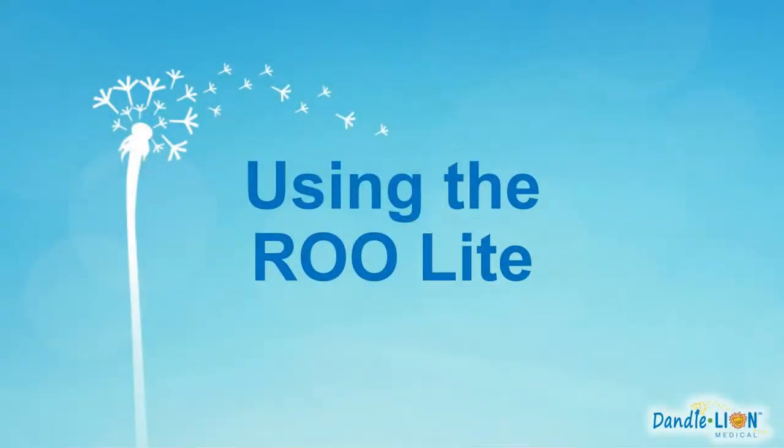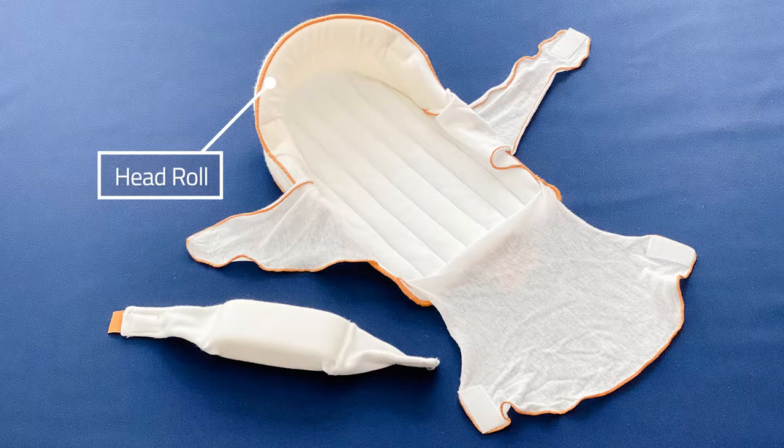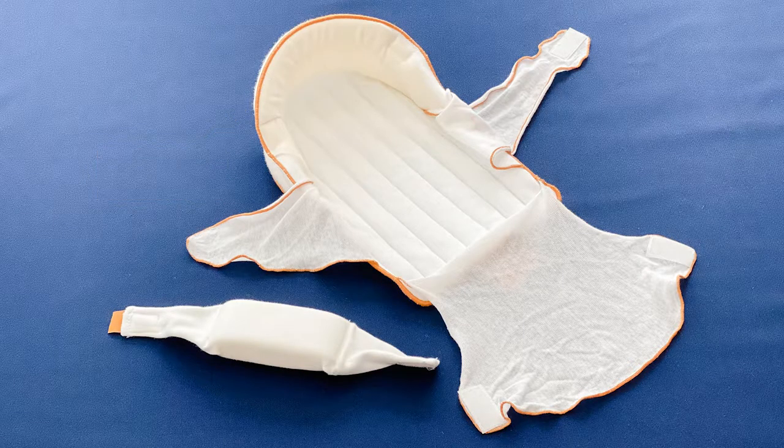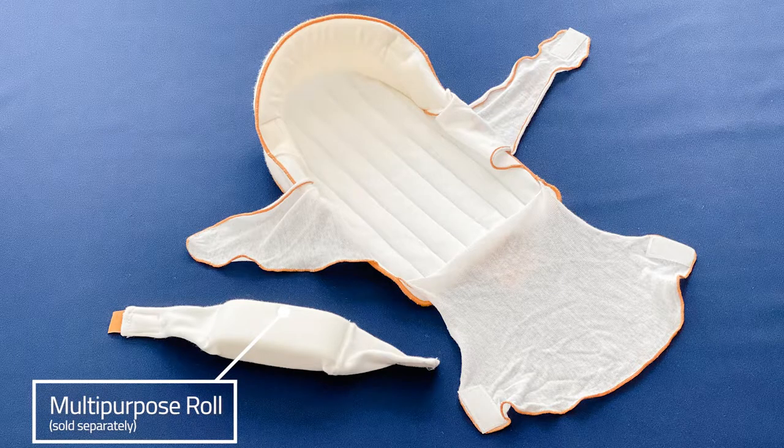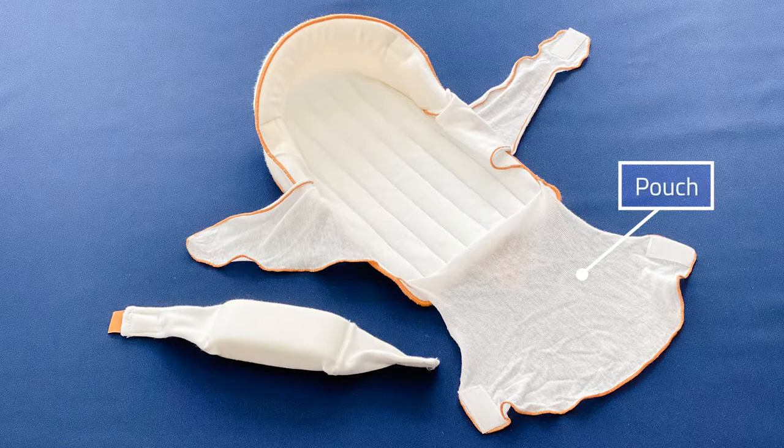The Dandel Rulite is an evidence-based positioning aid with four parts: a head roll, two wings to keep the arms in midline flexion, a multipurpose roll for optimizing position, and a pouch providing proprioception.